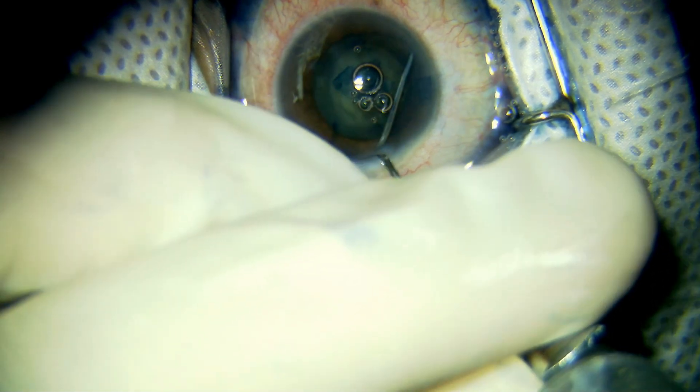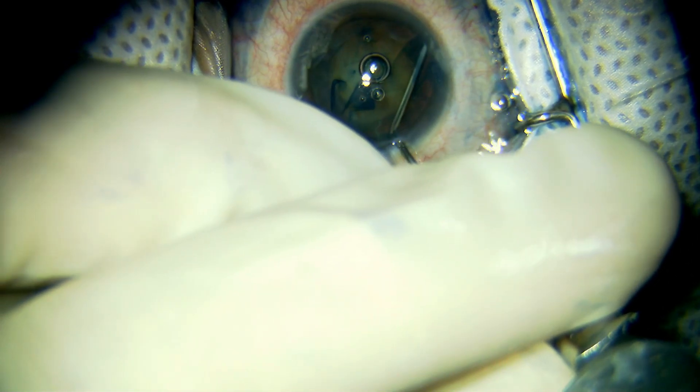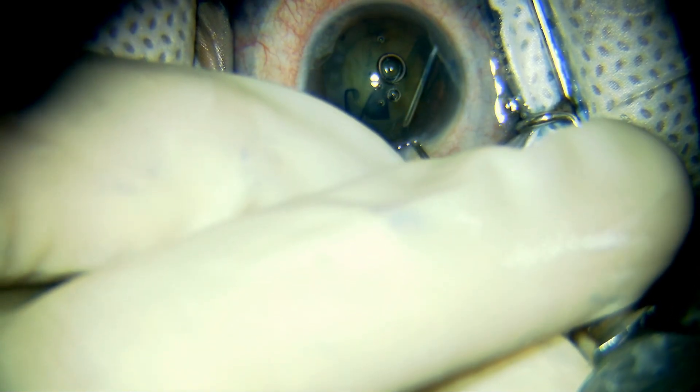Hydrodissection is being performed after lifting the anterior capsule and injecting the fluid.